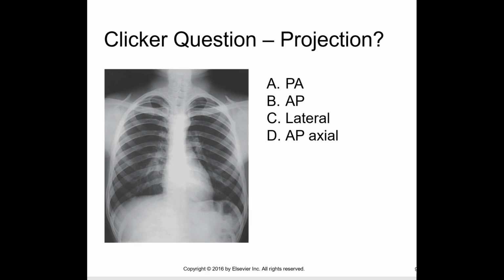This one's pretty straightforward. It would be a PA position, and I think this is the same one. There's too much neck showing here. I would collimate it, and also there's no marker.